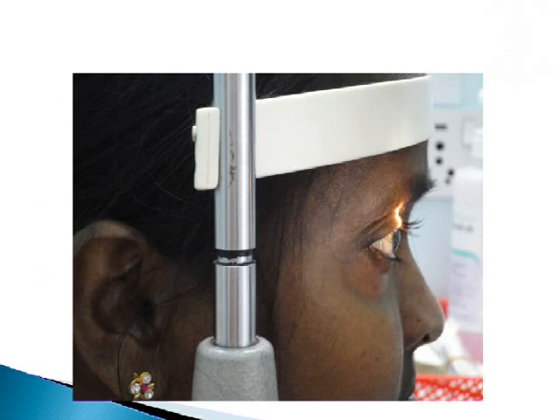This is how you seat the patient. Remember, the forehead also has to be in contact over here. If the forehead is not in contact, then you will be trying to push the slit lamp forward but will not get a focus.